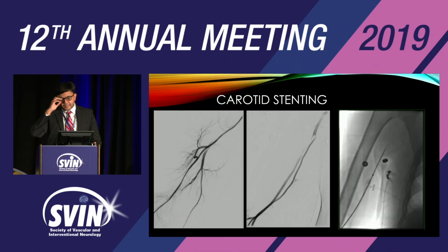So carotid stenting, and that's where it may get trouble, just because these patients have a lot of calcification. They have a lot of atheroma in the arch, they have atheroma in the femoral artery, and a lot of loops. So this is one case we did a few months ago, and again see it's a high bifurcation. And you can see the radial artery is actually around 2.3 millimeters.